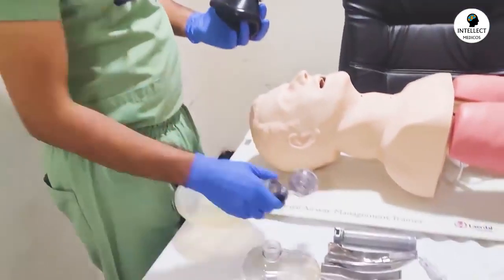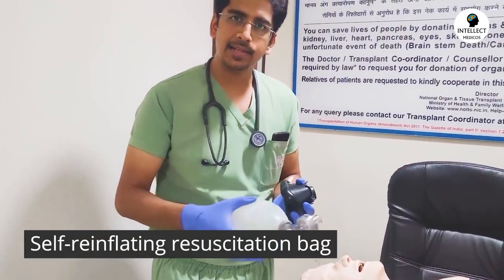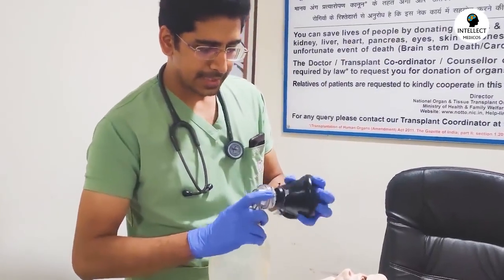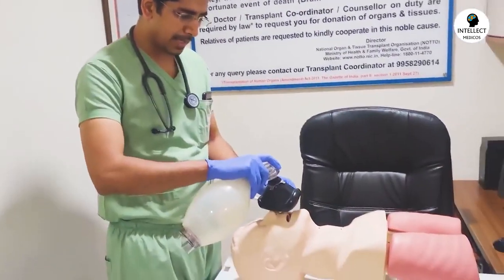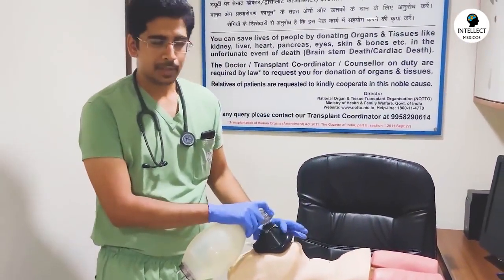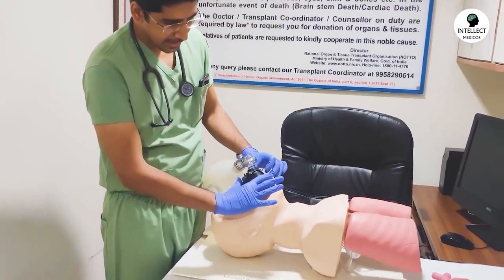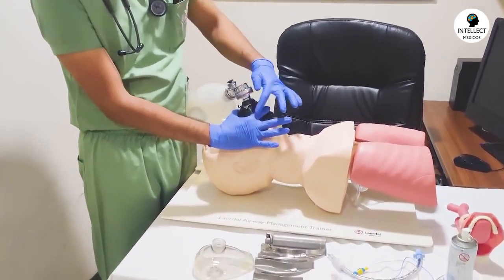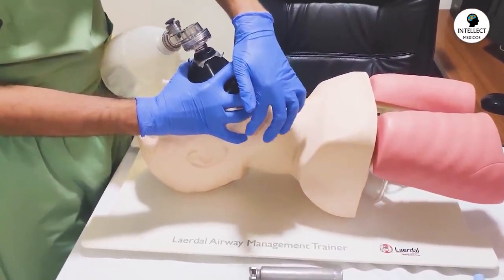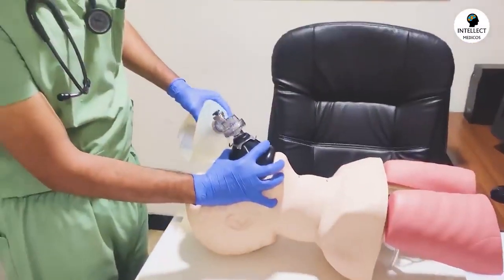Now, as I already said, this is a bag. This is called a self-reinflating resuscitation bag, also called an Ambu bag. Now, attaching it, you need to hold the mask with the C and E technique. Although I prefer to use my left hand, just to show you, I will show with my right hand. The thumb and the index finger should make a C, standing for compression of the mask onto the face of the patient, and these 3 fingers should make an E so as to elevate the jaw.